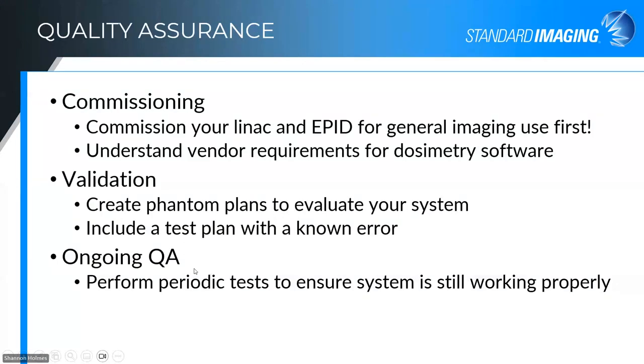Definitely. But of course, with every new program, there are new QA burdens. Indeed. There is quality assurance that needs to happen upstream on your EPID system. Can you talk a little bit about that? Yeah, absolutely. So TG307 really strongly recommends, in terms of commissioning your EPID dosimetry system, make sure you've commissioned your LINAC and your EPID for general imaging use first.